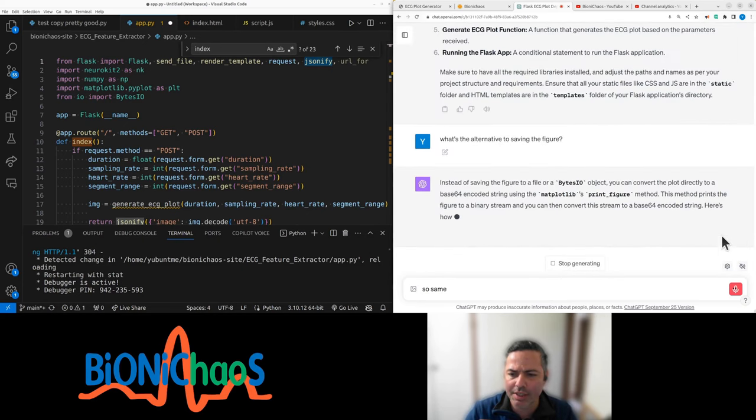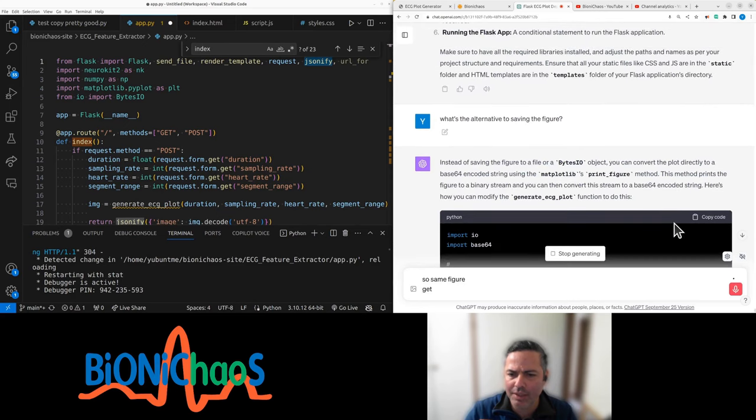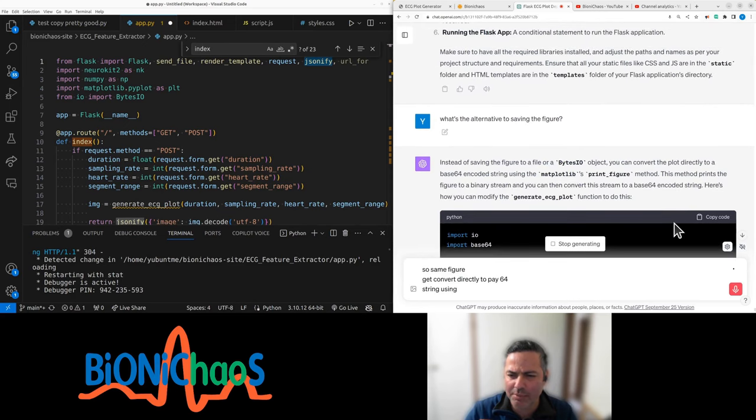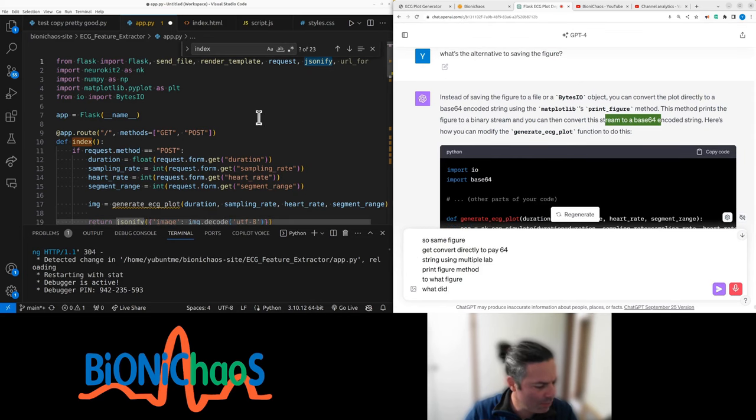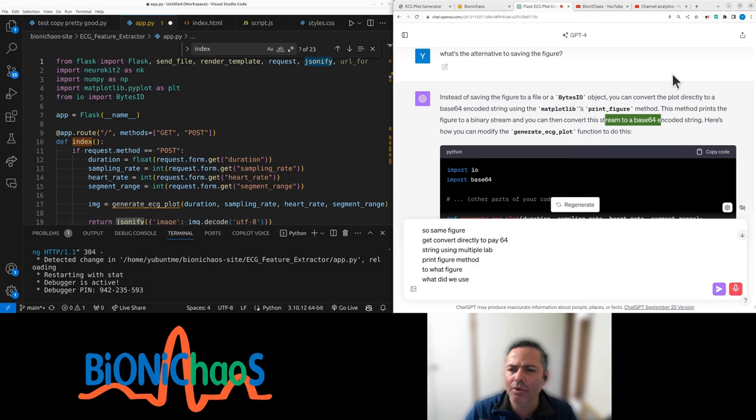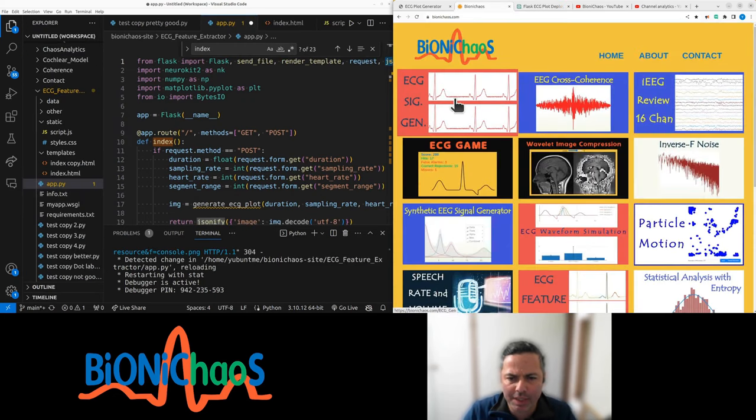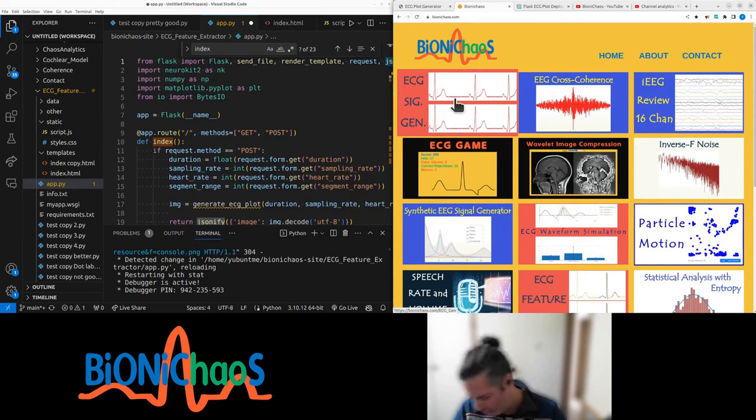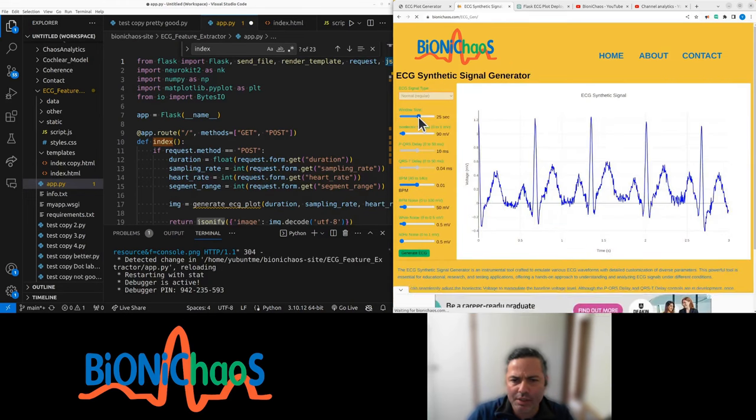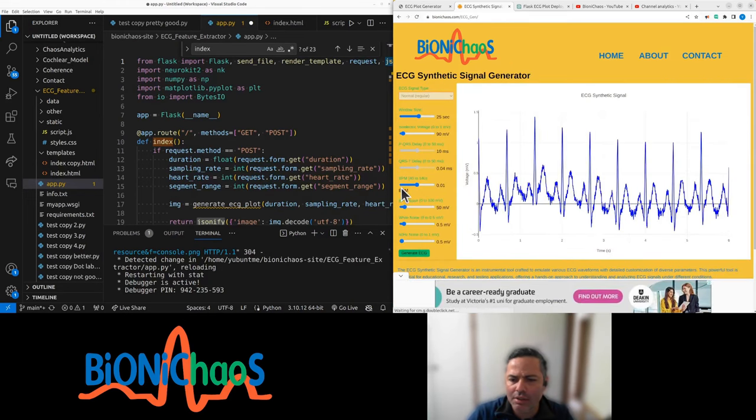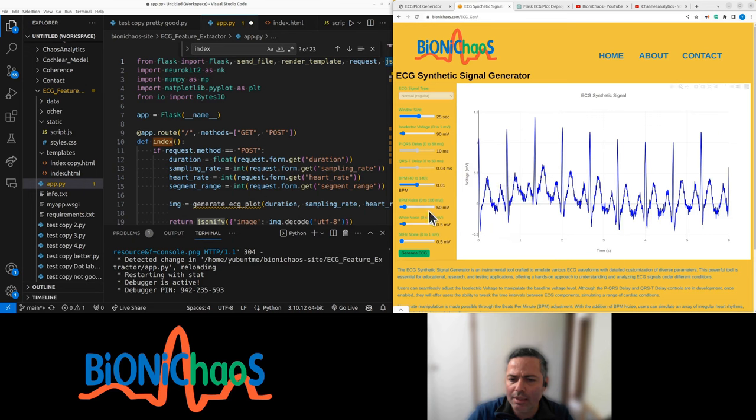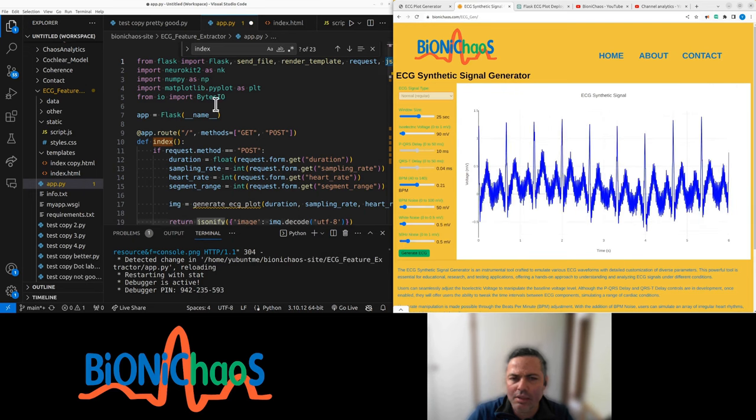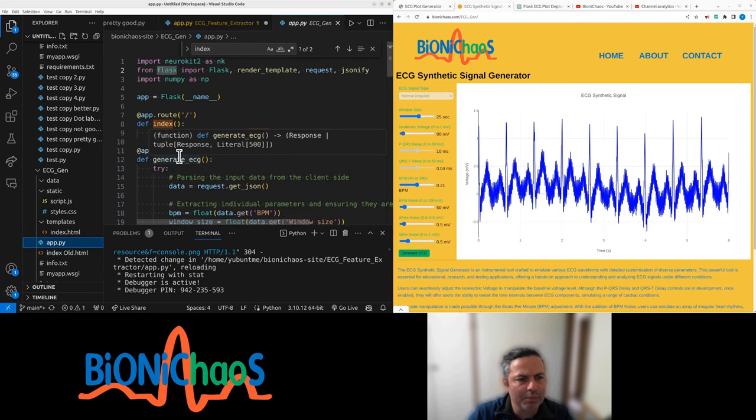Why are we saving figure? What's the alternative to saving the figure? You can convert the plot directly to base64 string using matplotlib print figure method. What did we use for previous applications? So far we have the ECG signal generator, it's working quite well. That was using numpy.